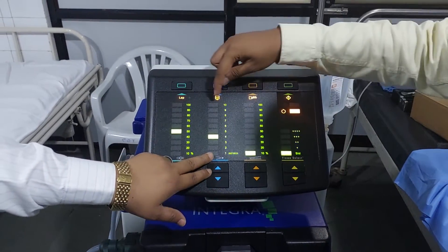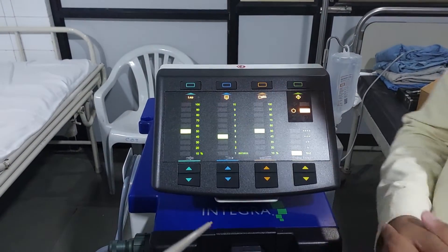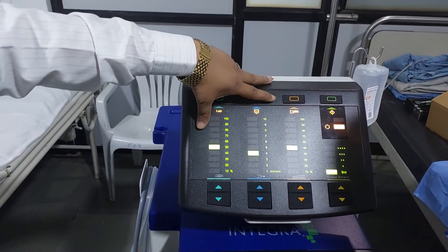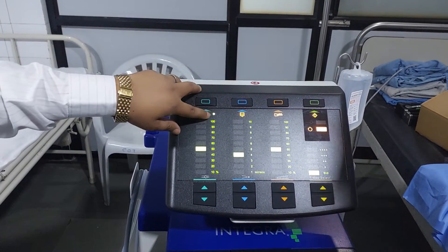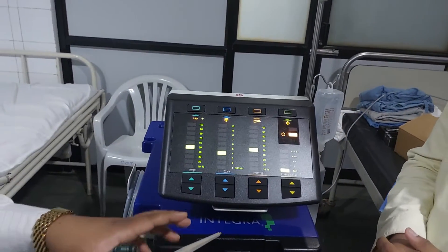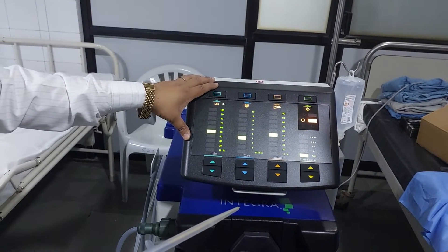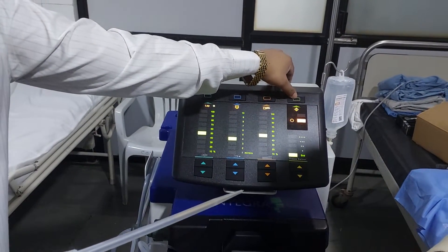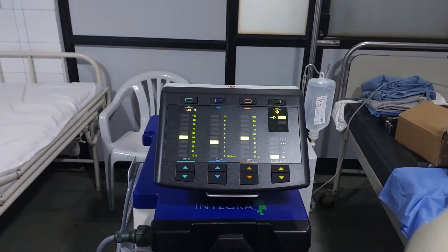You can adjust: this is suction, this is irrigation, and this is fragmentation — the surgeon will adjust these settings according to requirement. This setting is for open surgery. If you are using laparoscopic mode, press this button — the light will glow. In laparoscopic surgery, suction goes off because of the gas inside, to avoid it getting out. You can go to run mode by pressing this button.